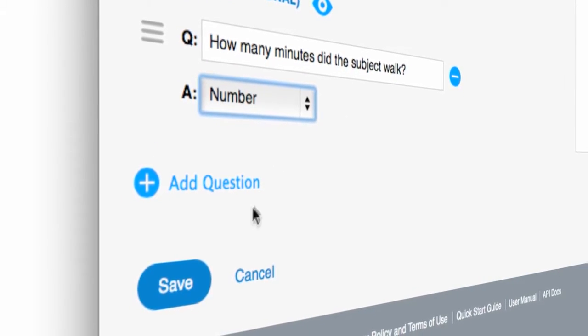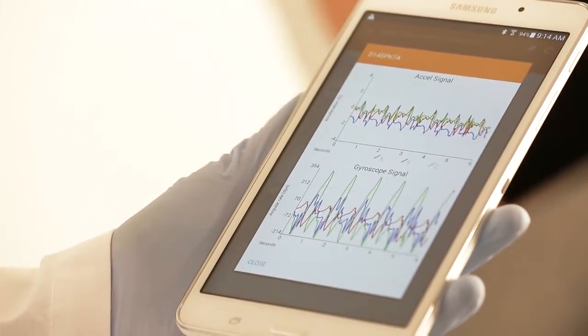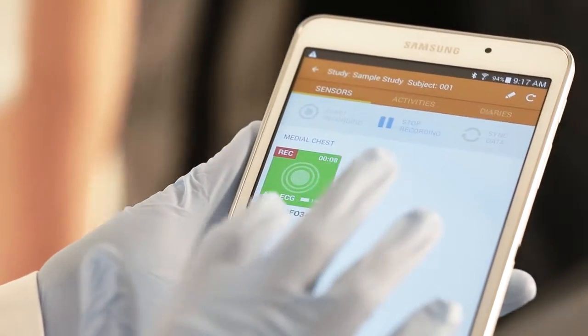Once the study is defined, use the Investigator tablet application to input subjects, assign sensors to subjects, start and stop recordings, and perform activities and diaries.